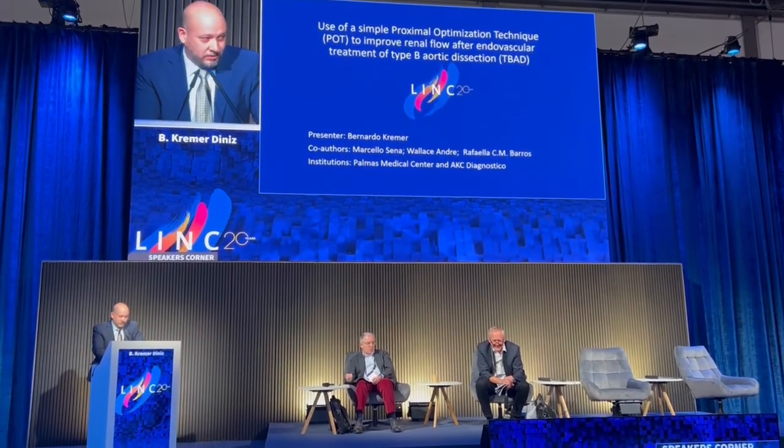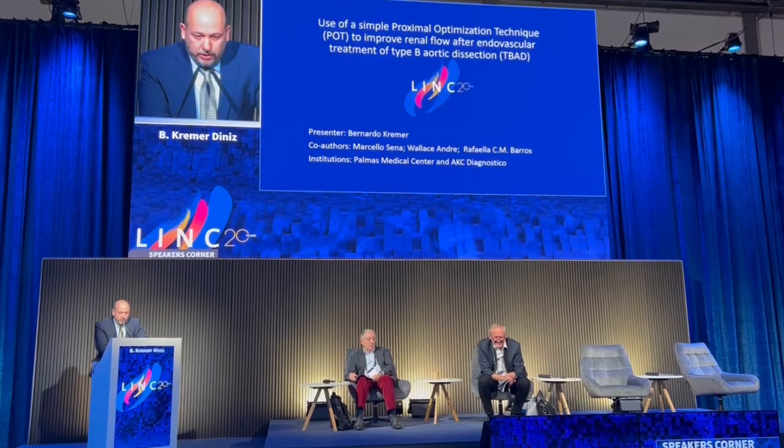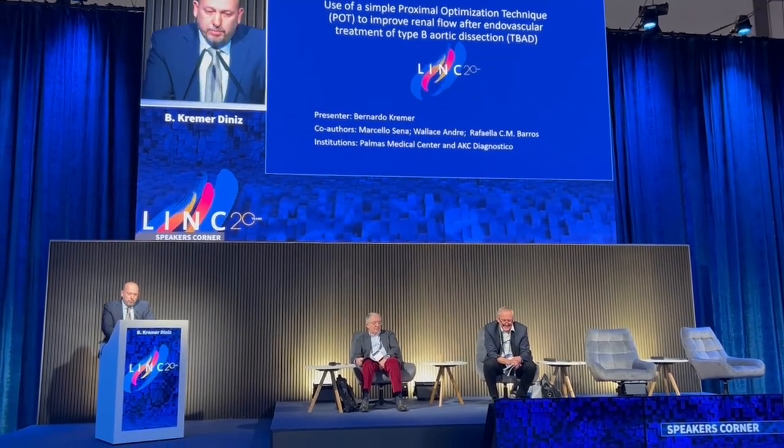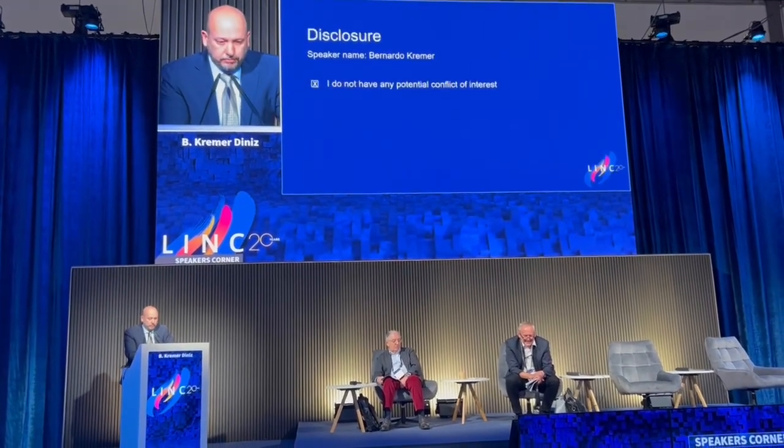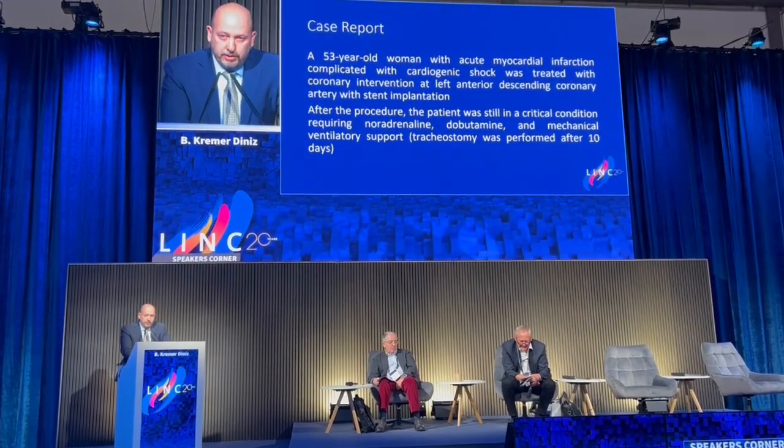So I hope my English is better than my German. I'd like to share with you a simple proximal optimization technique called POT that has been described only before in coronary arteries. There's nothing to disclose. Here's the case.